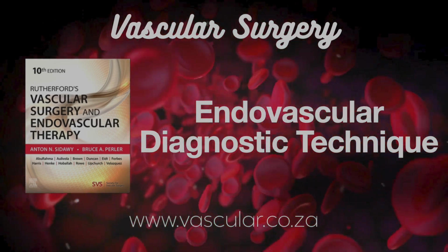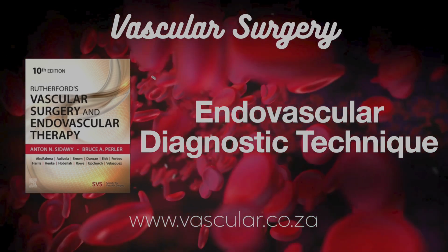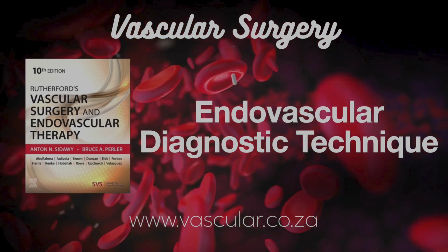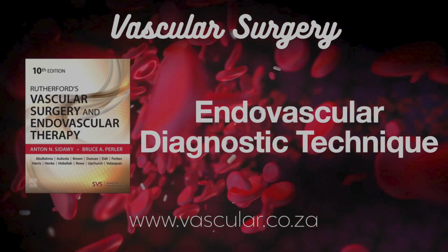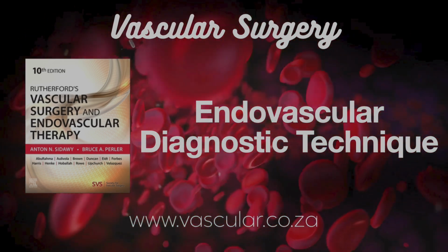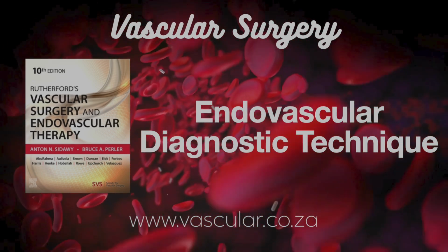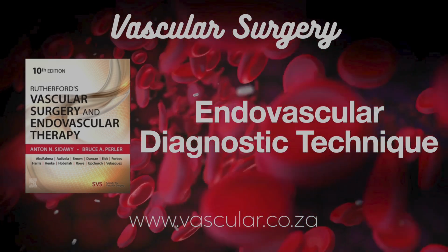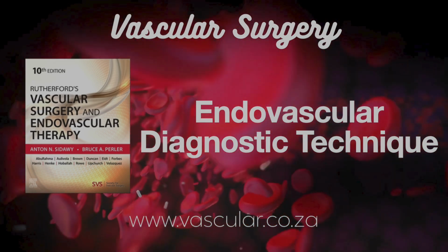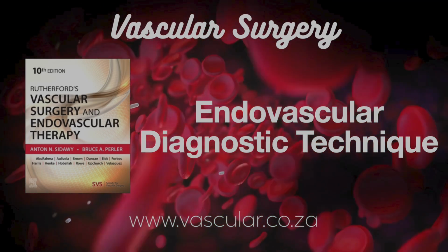I'd say it boils down to a few critical things. First, really careful selection of the right access vessel for the job and the patient. Second, smart use of adjuncts like ultrasound to make that access safer and more reliable. Third, picking the right wires and catheters; understanding your tools is vital for getting the diagnosis and avoiding harm. Fourth, achieving good hemostasis afterwards, whether manually or with a device. And finally, having a solid plan for each procedure, knowing the anatomy, mastering the tools, is fundamental to safe and effective practice. It really underscores the skill involved.